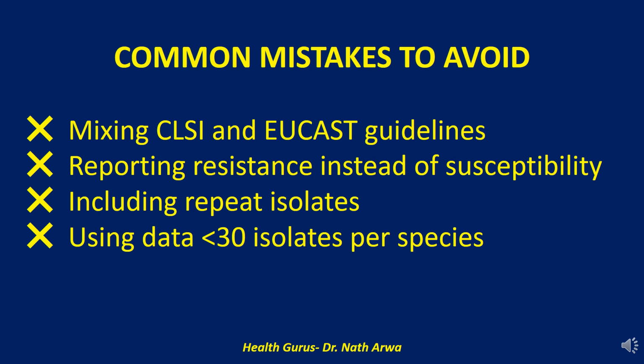A great antibiogram isn't just about the data. It's about avoiding the traps that can derail clinical decisions. So double-check your methods, and you'll be well on your way to delivering a report your whole hospital can trust.